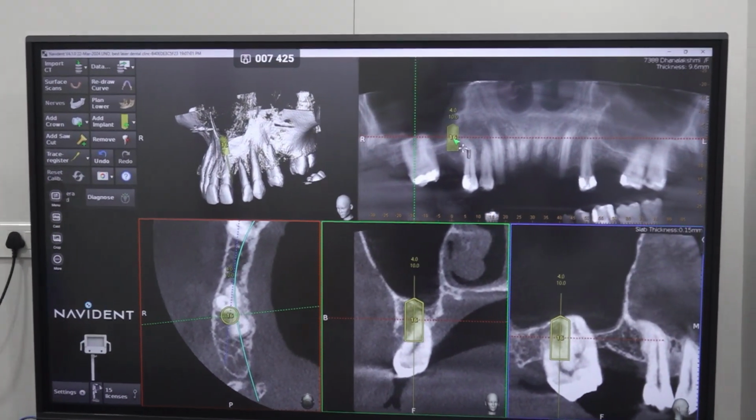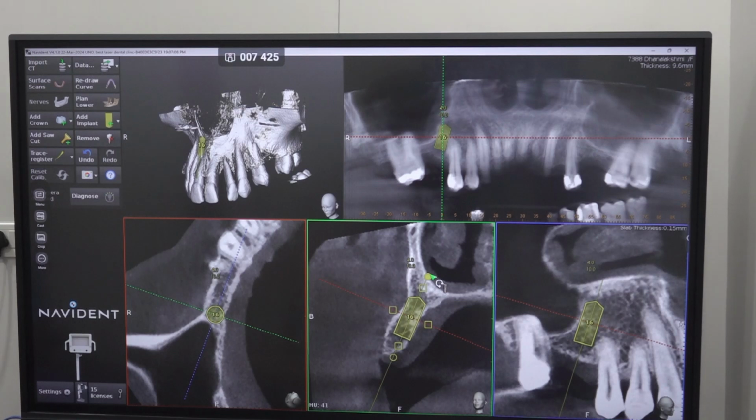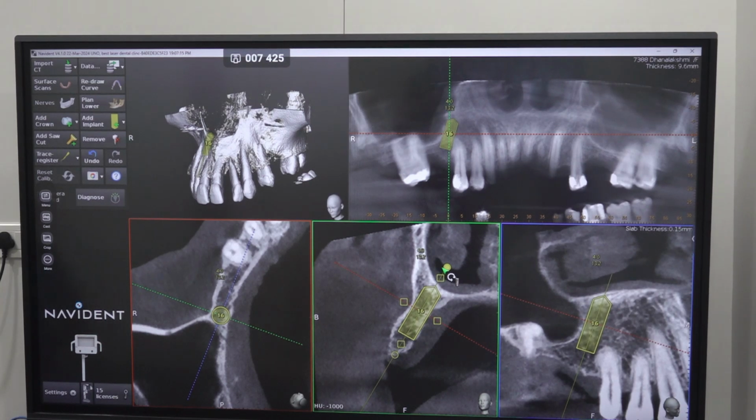So from the 6th area we can start our implant, but we have to tilt it medially. Yes, medially, like you do in all-on-4. Yes, exactly. It's also all-on-4 extended. Yes, all-on-6.